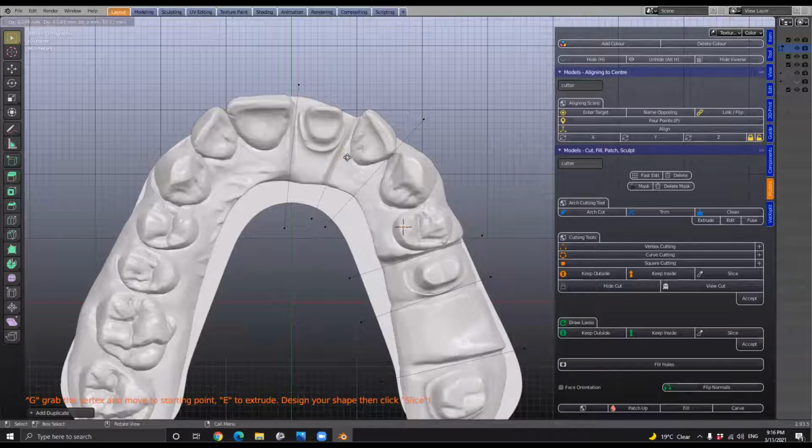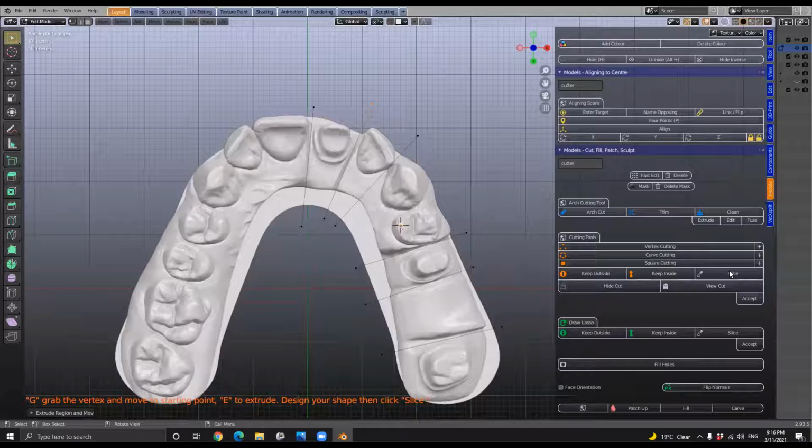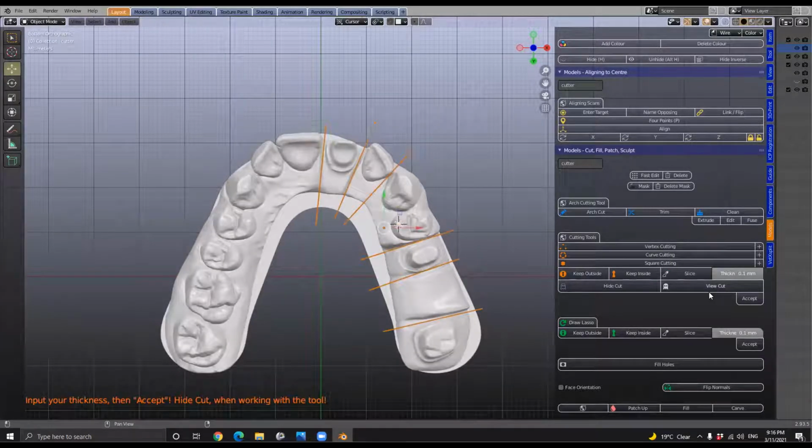And by the way, you can go zigzag. You don't have to go in one piece, because sometimes the dies are quite difficult. You can just go zigzag if you have to. Okay, based on that, we're going to make a slice. We've got a very similar menu in the crown and bridge work module, which does exactly the same thing.